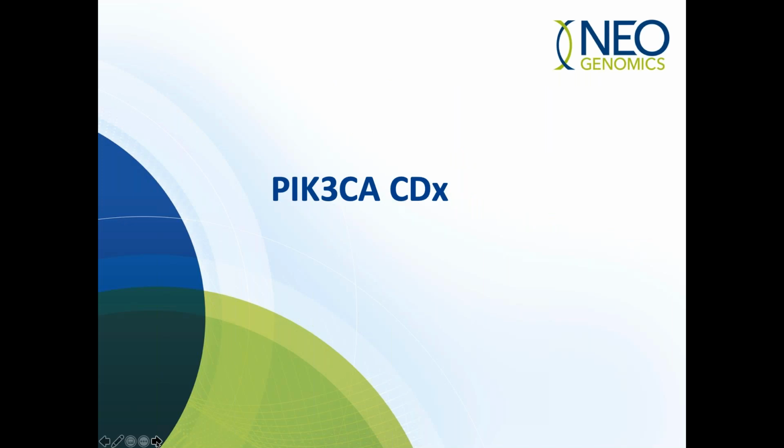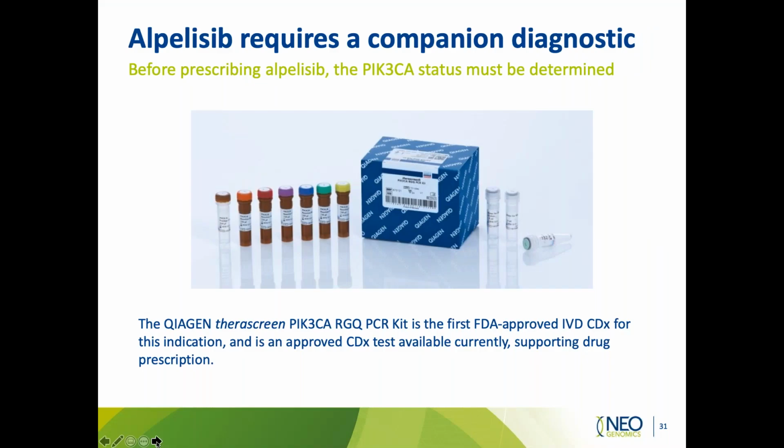So let's talk in more detail about the PIK3CA companion diagnostic of QIAGEN. Next. So, as stated, alpelisib requires a companion diagnostic, and obviously, before prescribing the drug, the PIK3CA status has to be determined. The QIAGEN TheraScreen PIK3CA RGQ PCR kit was the first FDA-approved IVD companion diagnostic for this indication, and supports the drug prescription. Next.